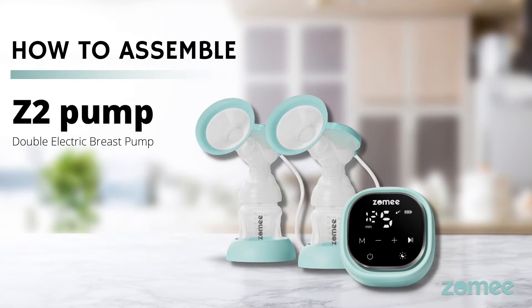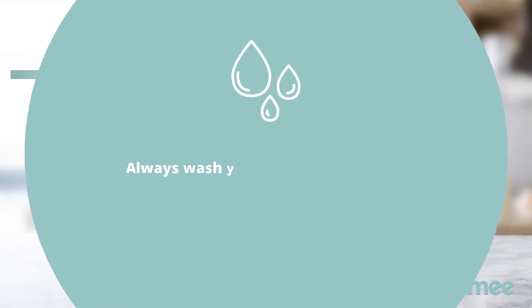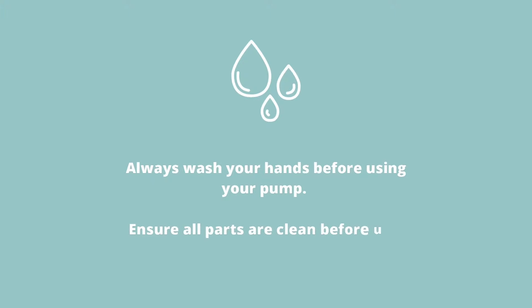How to assemble your Z2 Pump Double Electric Breast Pump. Always wash your hands before using your pump.